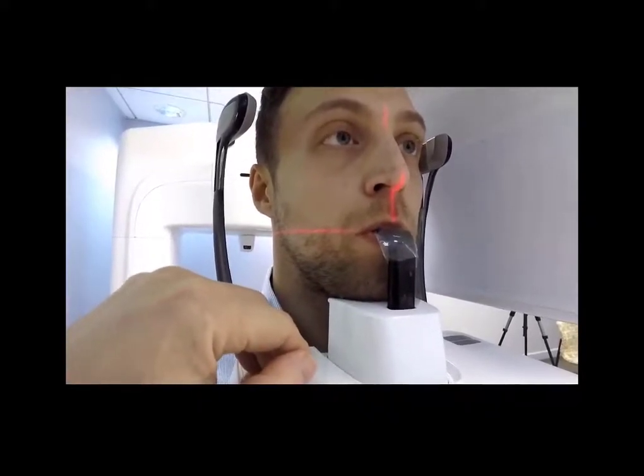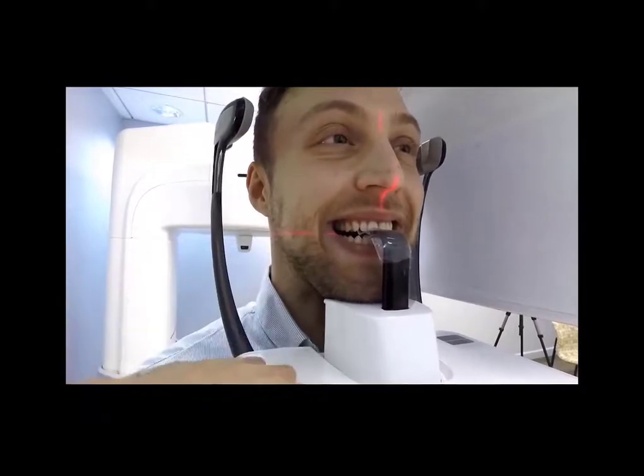And if you would, go ahead and smile for just a moment and see how the light is pretty much going right where the bite stick is there as well. It helps us verify that we are capturing a dual arch scan itself.